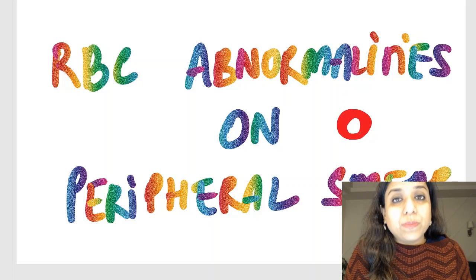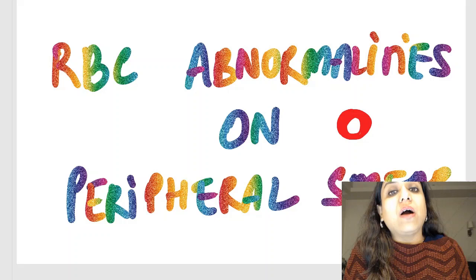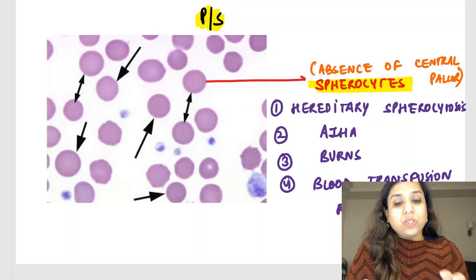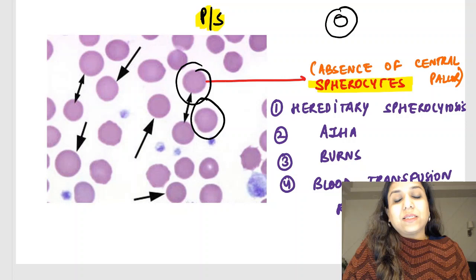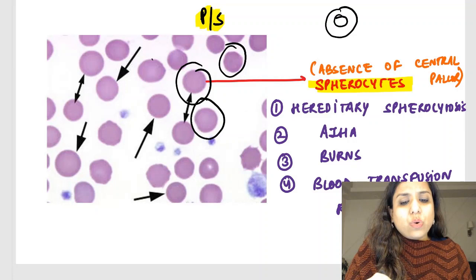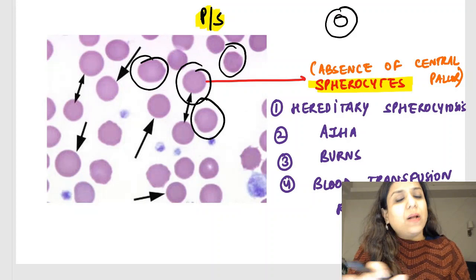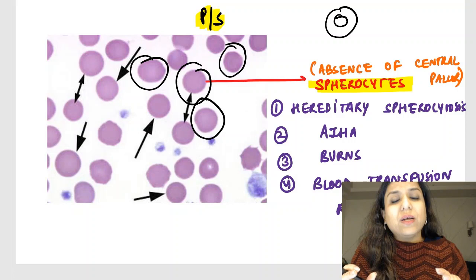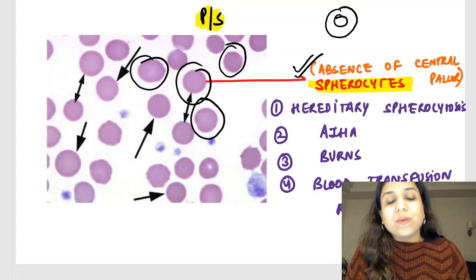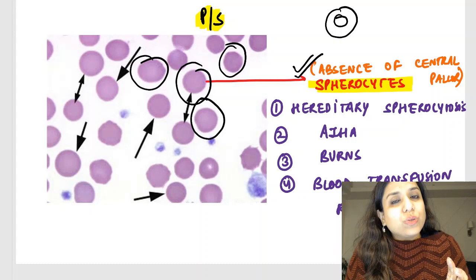In this section we are going to discuss the RBC abnormalities on a peripheral smear. When a pathologist sees a peripheral smear, what are the things which I can see in the RBCs? First, let us see this image. Can you appreciate these red blood cells? Do you think these RBCs are normal? Whenever I draw a normal RBC, it has a central one-third pallor. Can you see any pallor in these RBCs? Notice all of these RBCs — I don't see any pallor. They are consistently pink or purplish. There is no pallor and also there is a reduction in size and they are quite rounded. So these cells are called spherocytes.